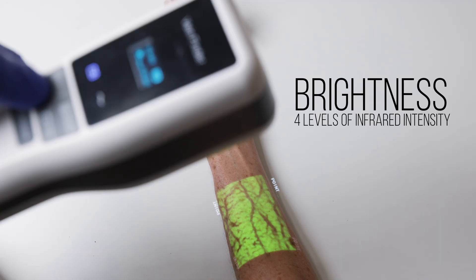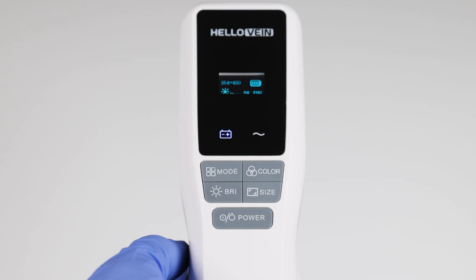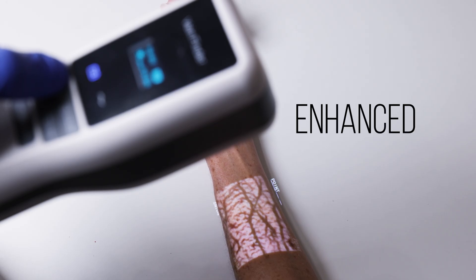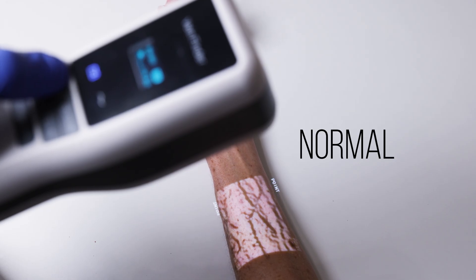There are four different brightness levels — I'll cycle through them. There's also a really cool feature with three modes: enhance mode, normal mode, and depth mode. Here you can see the enhance mode, then the depth mode, and then the normal mode.